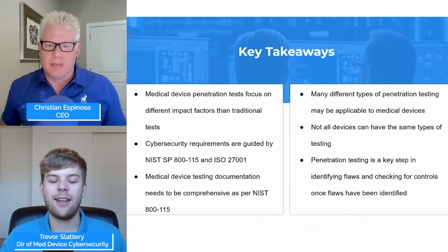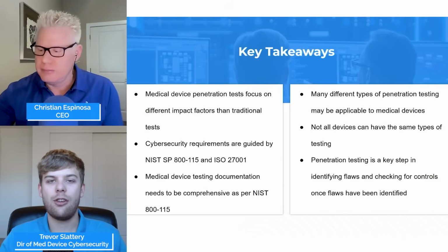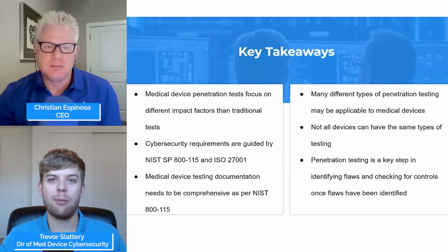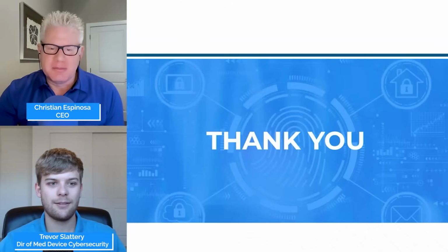Finally, penetration testing is a key step in identifying flaws and checking for controls once flaws have been identified. This should be a very important part of any risk management process and baked in early and often into the device. All right, awesome. Great job, Trevor.